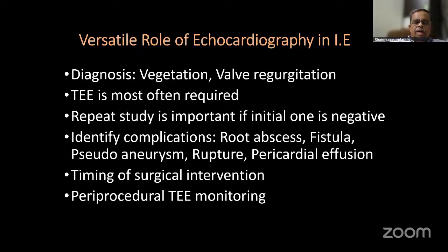And it also helps you to monitor during procedures, before and after surgical intervention, during percutaneous interventions for infective endocarditis, particularly the right-sided infective endocarditis. It is going to be of great use.